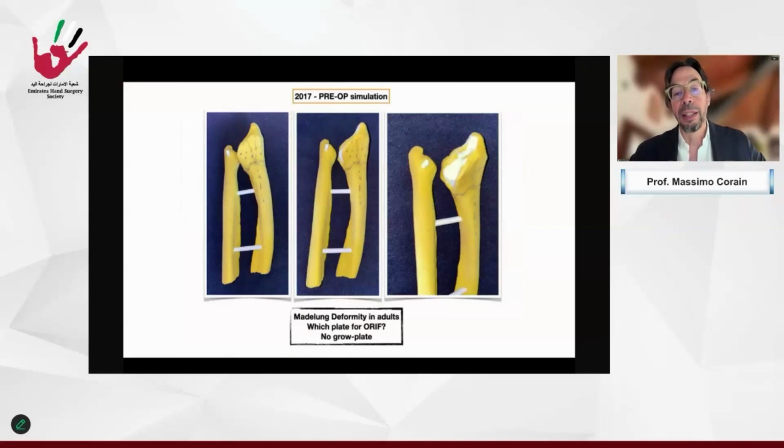But this 3D planning was a necessity to understand in a better way where to perform the osteotomy and which plate to use, because during the growing age the plate is often too large, and I had to use an ulnar plate that is shorter and straight, and was not naturally indicated for the distal radius, but for Madelung was very good. And I could use it while simulating the surgery on this 3D printing.